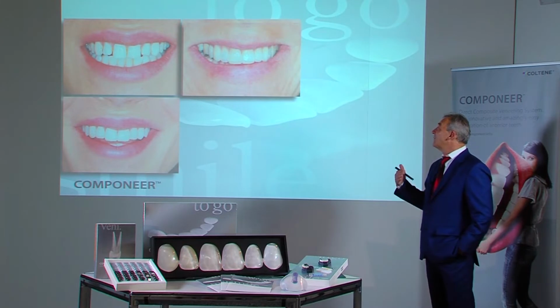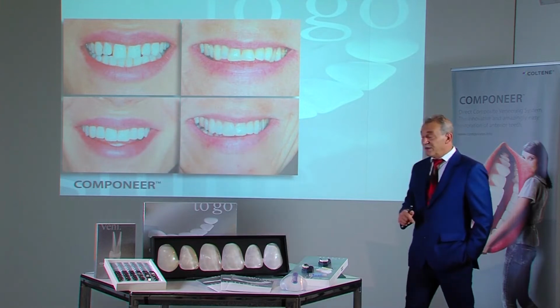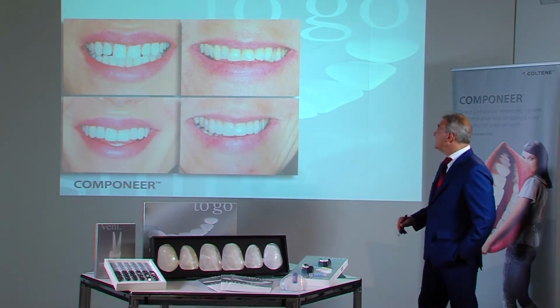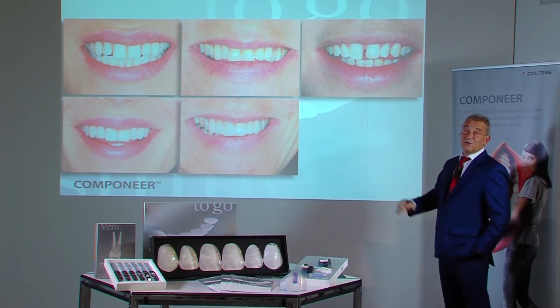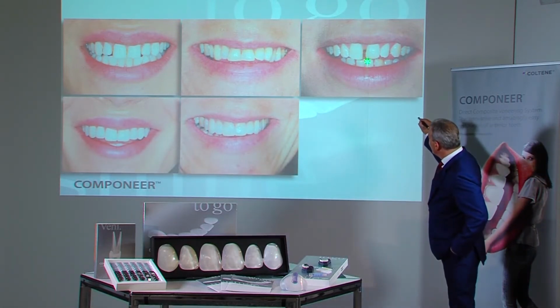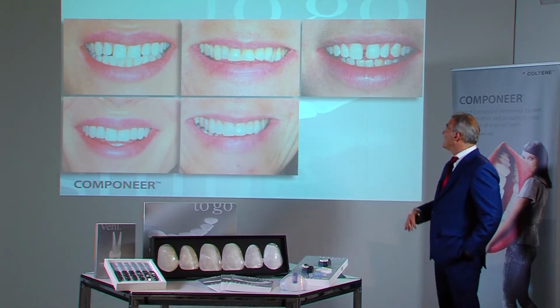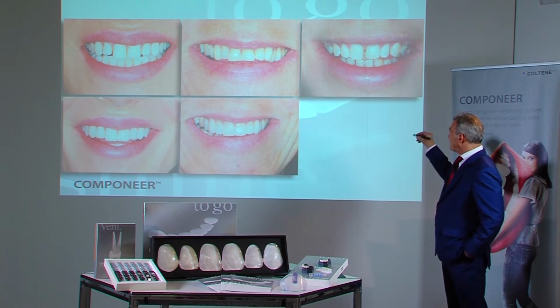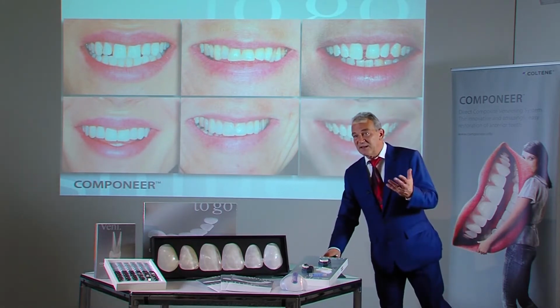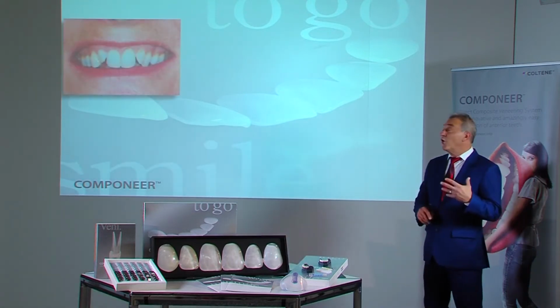Especially if I can tell him or her it can also be done with no or little preparation. The patient appreciates that as I perform the diagnosis without conditioning, without grinding, I place the composite in the interdental space, close the optical triangle to the cuspid, and immediately things look completely different. The facial expression, the smile, everything changes. This often happens in situations where patients think that nothing can be changed.